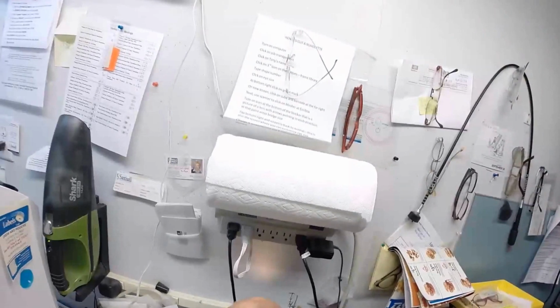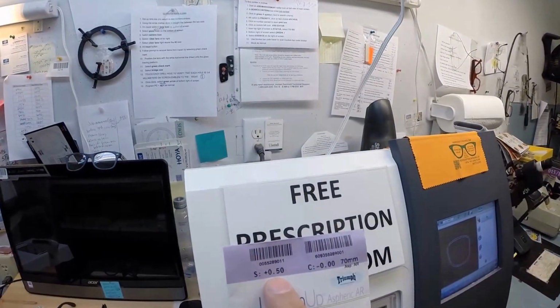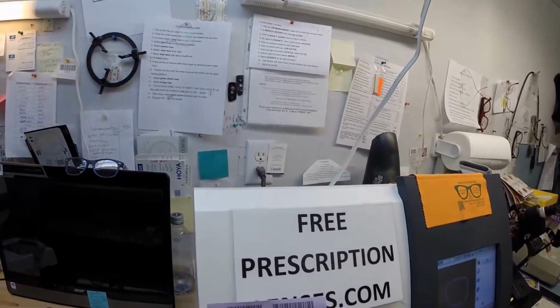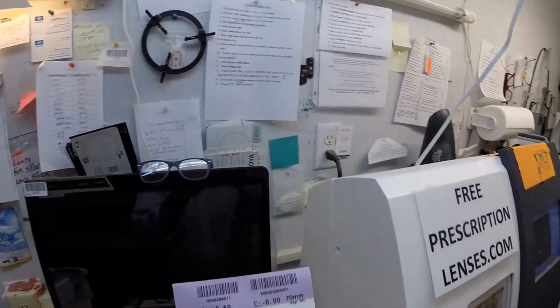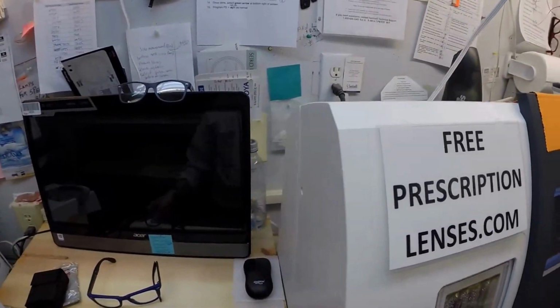Now you are farsighted. You need 2 steps of magnification to help you see up close on the computer with all the studying you're doing. That's why your lenses are plus 50. You have 2 steps of magnification that is necessary. You have no astigmatism correction, which is like the fine-tune knob. Astigmatism is what makes 6s and 8s look alike, or the letters P and F. You do not have that issue.